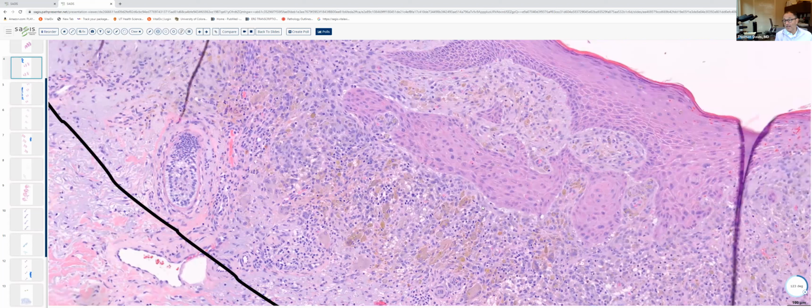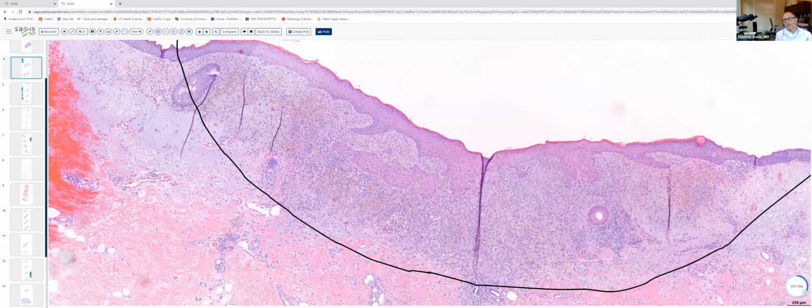Aluminum chloride does not produce as brisk of an inflammatory reaction when it is used. And sometimes Monsel's can produce even a more robust inflammatory infiltrate. It can produce almost a pseudosarcomatous reaction in the skin. So Monsel's reaction, I for sure will be able to recognize this for a core examination.